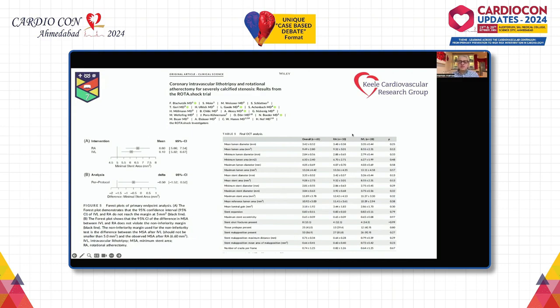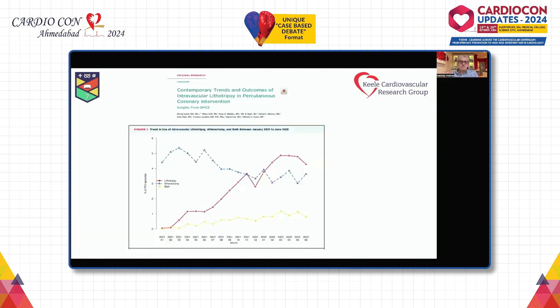When you looked at OCT analysis and a whole load of things, everything from stent expansion, stent strut fractures present, tissue prolapse, minimum luminal area, maximum luminal area, mean stent diameter, mean stent area, exactly the same. So we can say that when used, both have very similar outcomes.